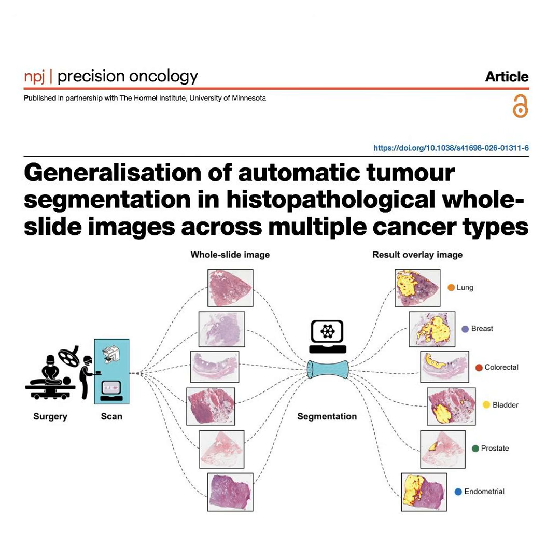So to build this pan-cancer model, like a truly universal diagnostic tool, the researchers really had to start with the data diet. Exactly. The foundation of any machine learning model is what you feed it. Because before an AI can diagnose a universal concept of cancer, it needs to be fed a massive, highly curated data set. And they did just that. They compiled over 20,000 whole slide images. We'll just call those WSIs for short. Right, WSIs. And these were gathered from over 4,300 different patients.